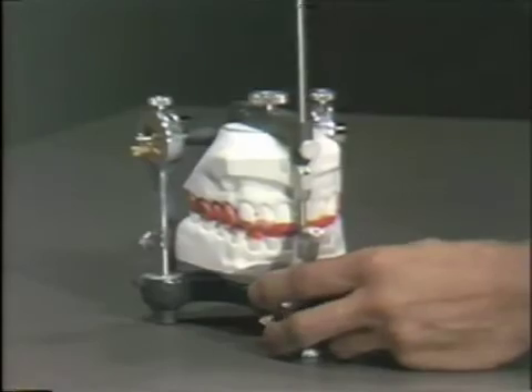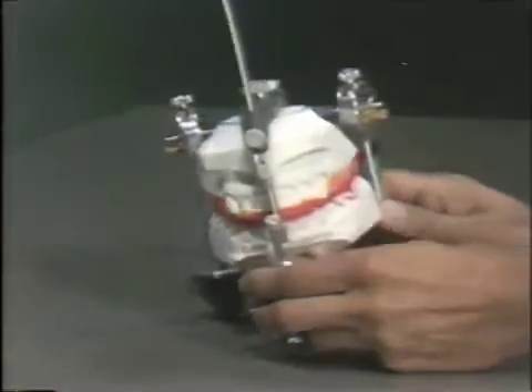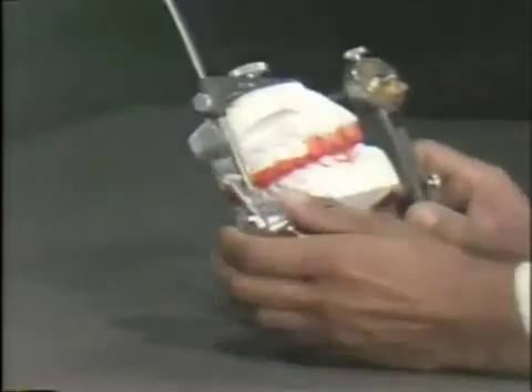That is what we would like to see in an occlusal analysis and will require adjustment. If we look at the left-hand side of the mounted cast and go into a lateral excursion — this would be the left working — we notice that the cuspid, number 11, the left cuspid, does the guiding in this lateral excursion.